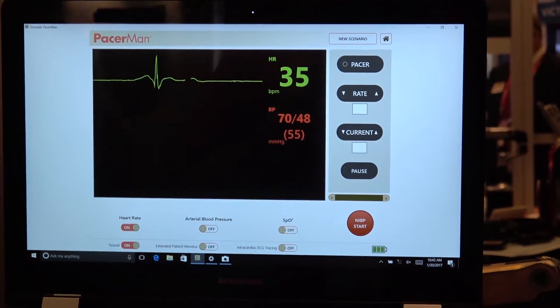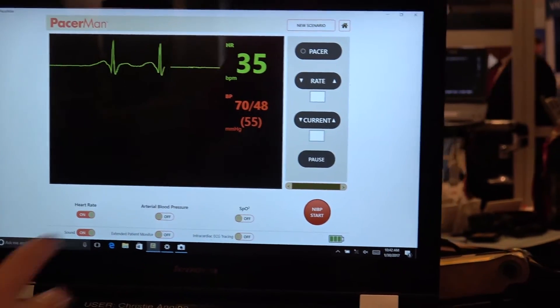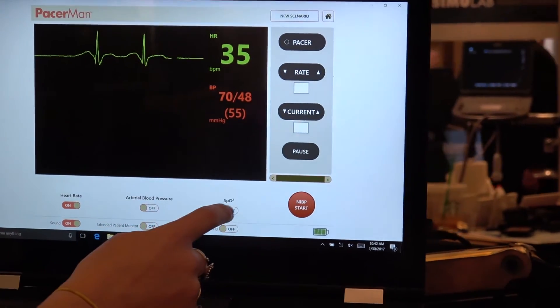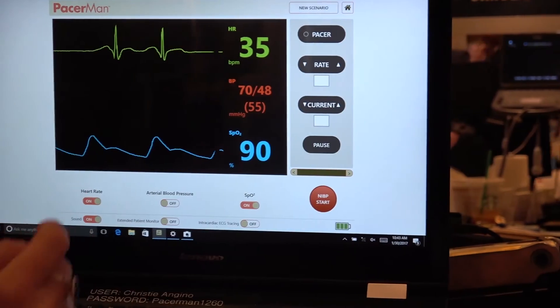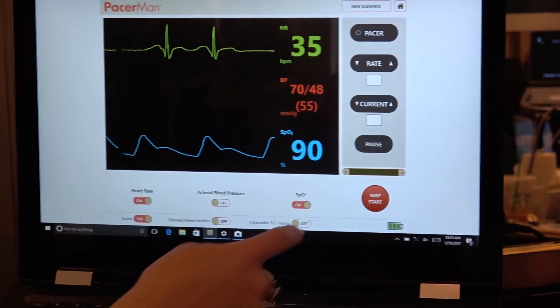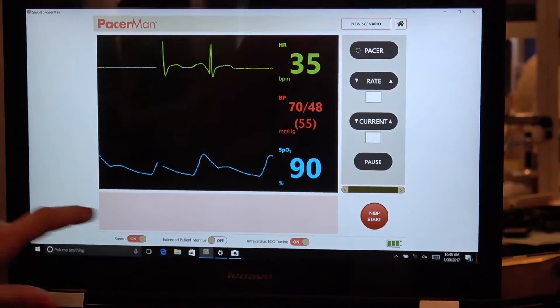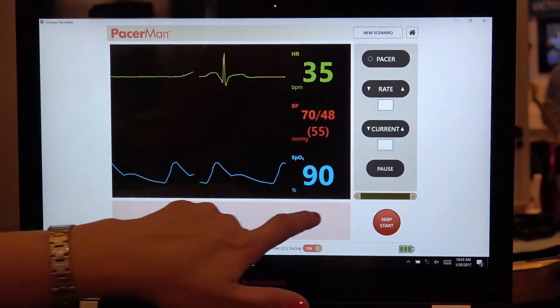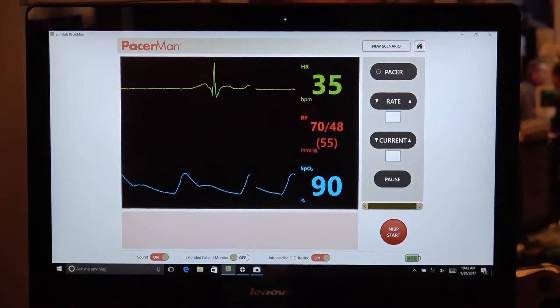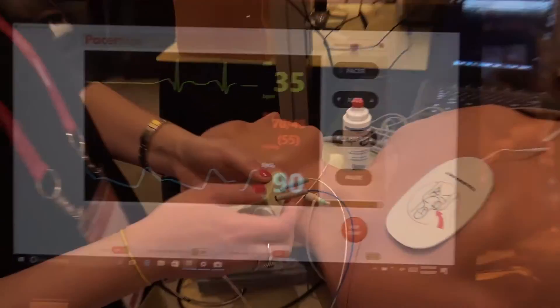We can choose the vitals we want — we have arterial blood pressure or non-invasive blood pressure that, once we recycle it, will match the patient's state. We also have an EKG strip here as well.